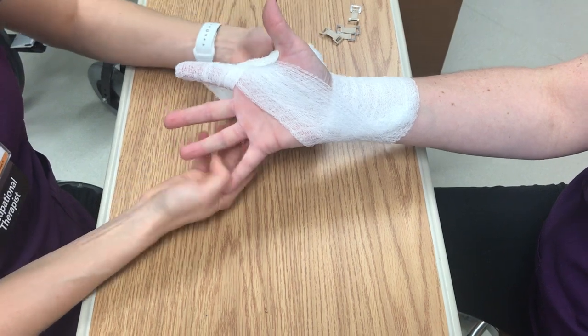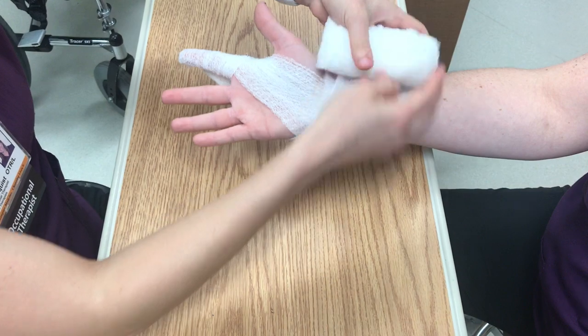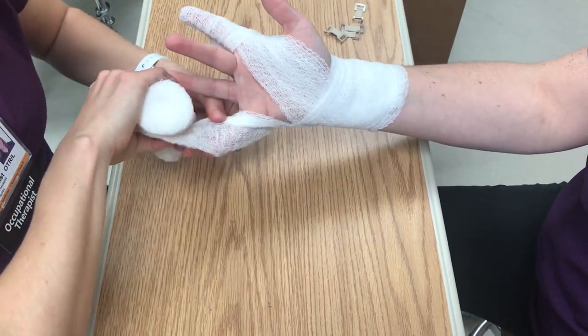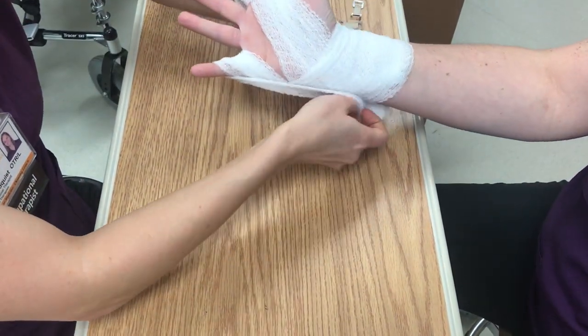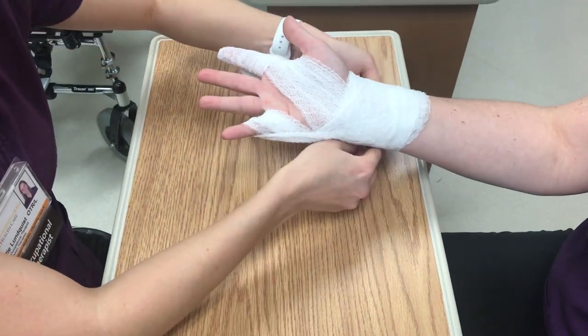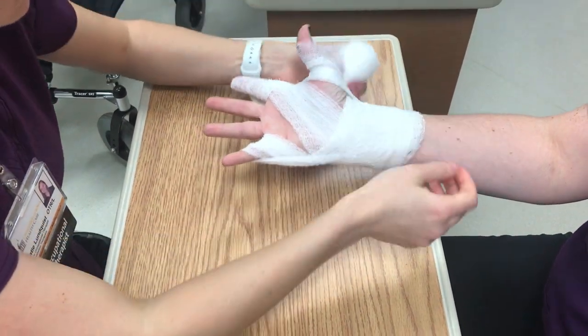This is how you pull that index finger into abduction. Take the pinky and then we're pulling out this way, again to help with that. You can just do that to all the different digits, pulling them out.